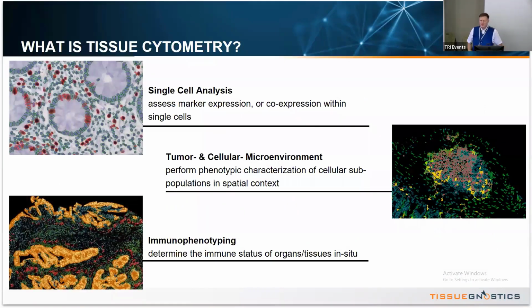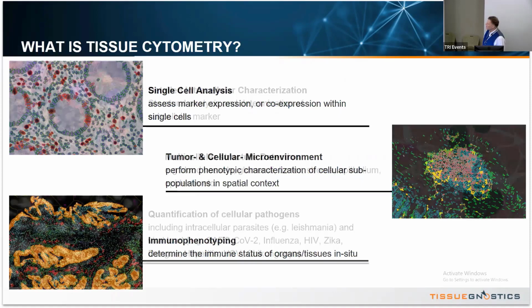So what is tissue cytometry? It's the idea of flow cytometry brought to the tissue section, where by use of image cytometry, we automatically identify individual cells in tissue context and quantify how much staining is associated with each. We can also look at multicellular structures like glands, glomeruli, and tumor foci, and then make connections to, for example, tissue-infiltrating leukocytes, which is called spatial immunophenotyping or spatial biology in a sense. We refer to it as contextual tissue cytometry.